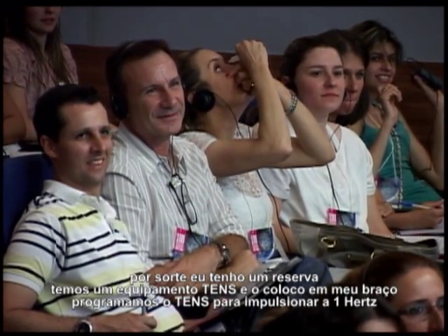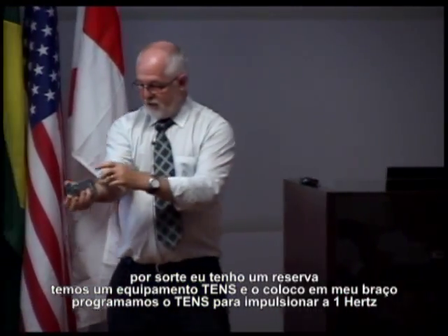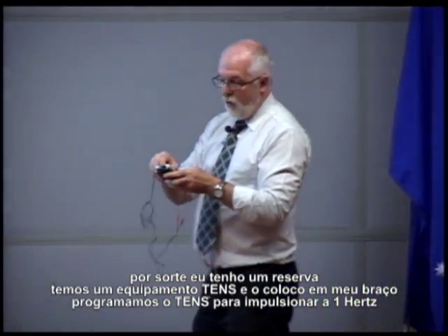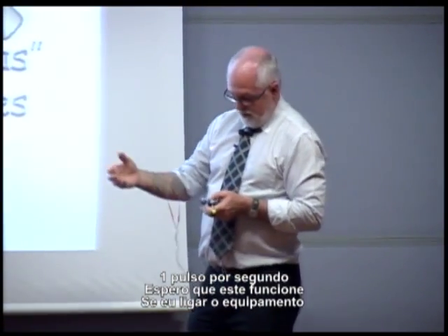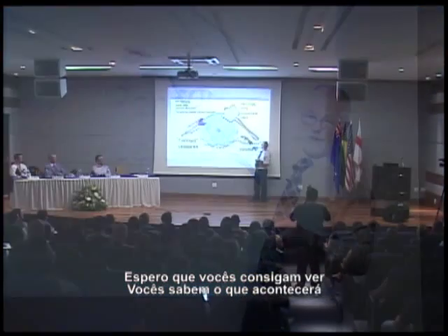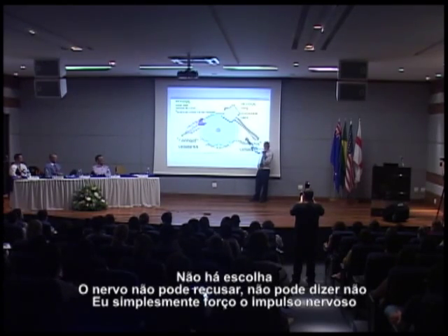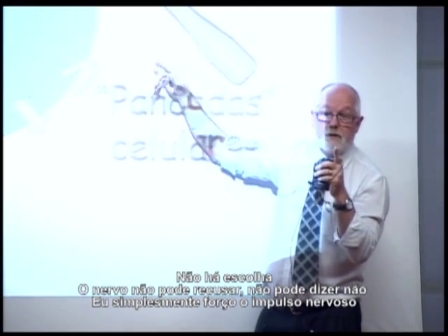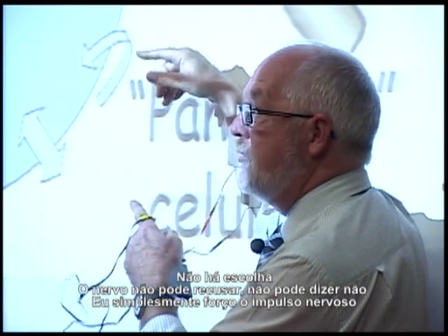We have a TENS machine, and we put it on our arm, and we set the TENS machine to fire at 1 hertz, 1 pulse per second. Let's hope this one works. All right. So if I turn the machine on, you see, hopefully you can see, you know what's going to happen. The machine fires 1 time per second. It makes my motor nerve fire 1 time per second. It's got no choice. The nerve can't refuse. The nerve can't say no. I simply force the nerve to fire.